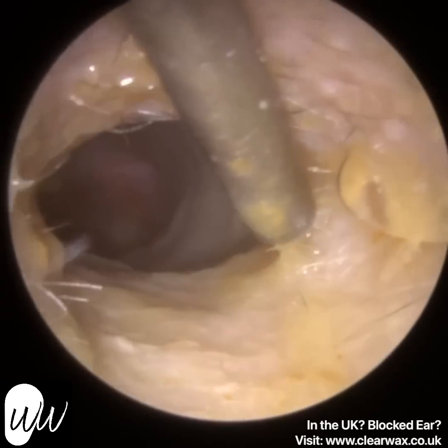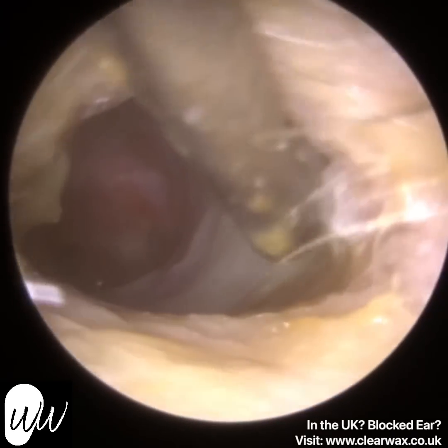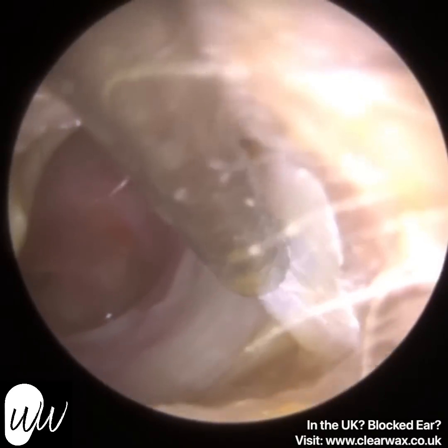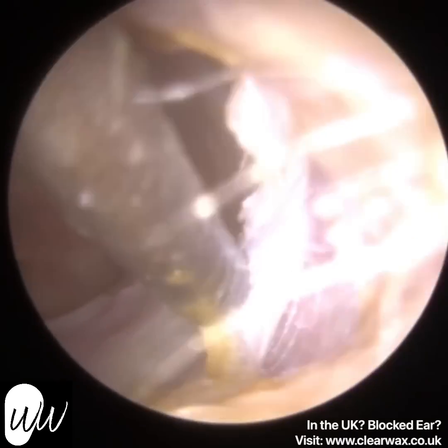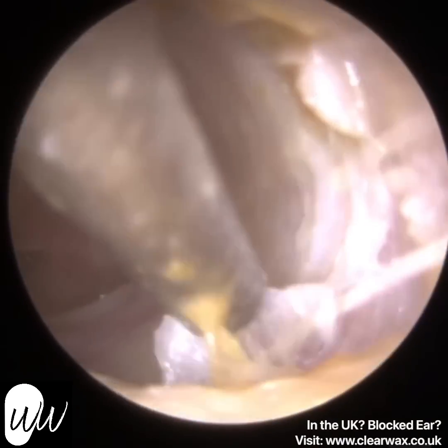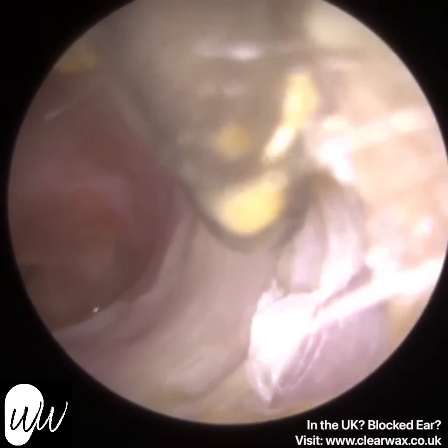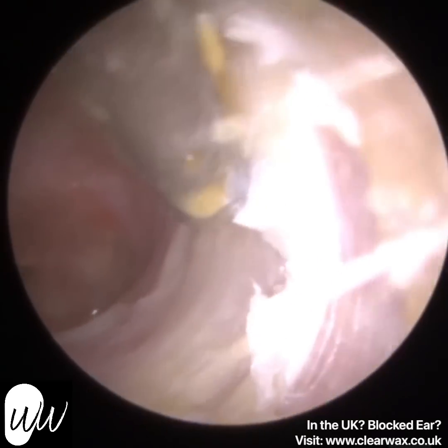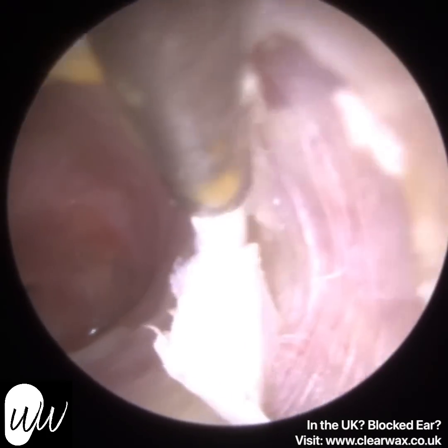So the patient has got multiple perforations of the eardrum and the eardrum's inflamed. It's a condition called myringitis. And we just can't recognise any of the landmarks of the eardrum due to this infection and all the discharge. So myringitis is an inflammation, an infection of the eardrum itself, so that's the term given.